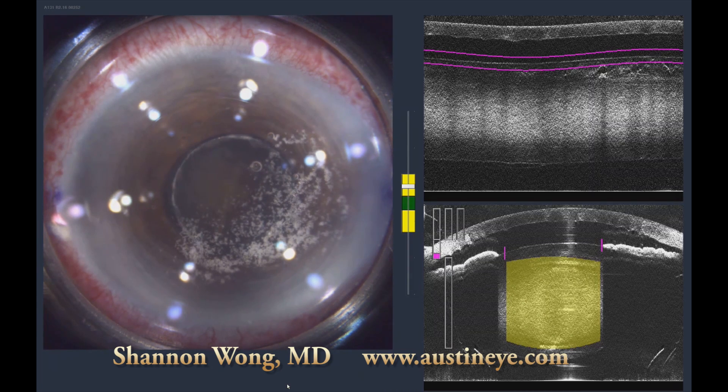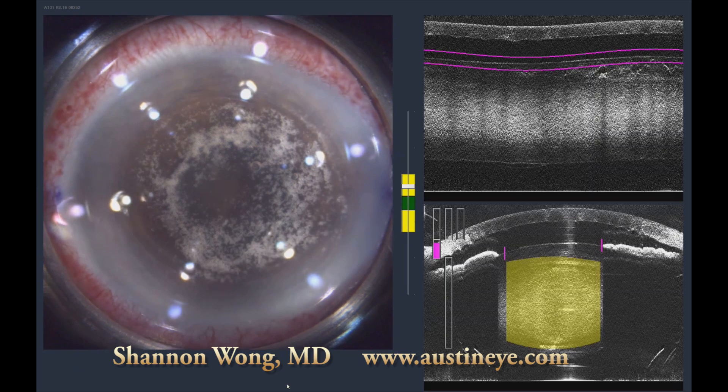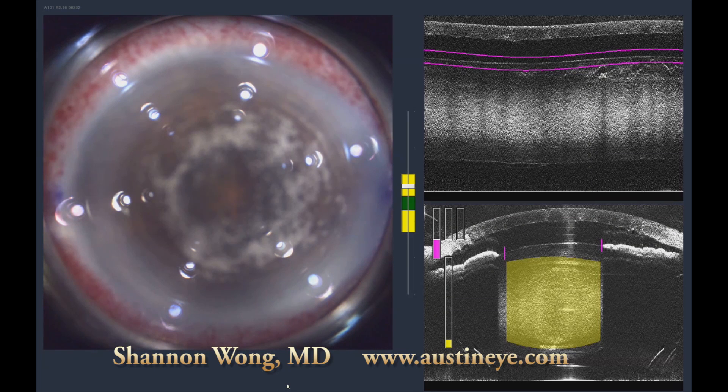We proceeded with the capsulotomy, and thankfully the pupil remained dilated beyond the 4.5 millimeter zone, so our capsulotomy was completed uneventfully. You can see the LensX laser is able to easily penetrate the brunescent lens, and we get a good bubble layer between the posterior capsule and the nucleus.